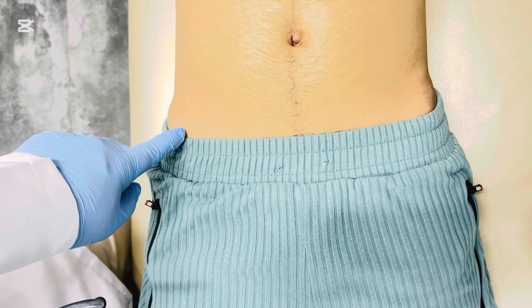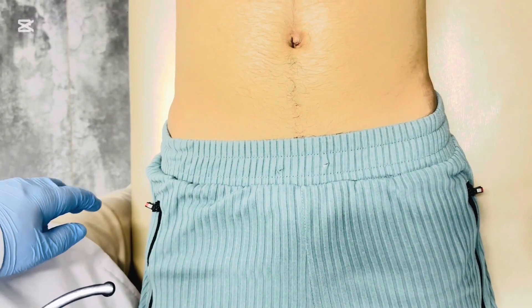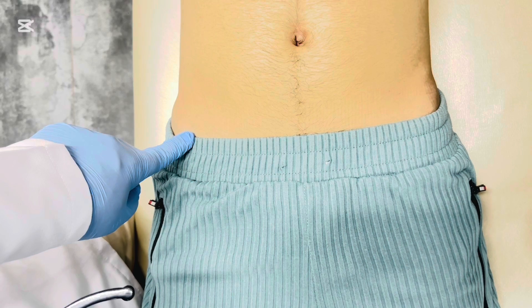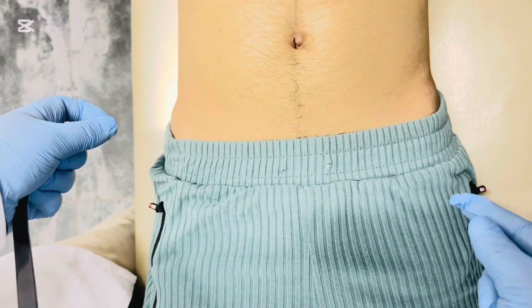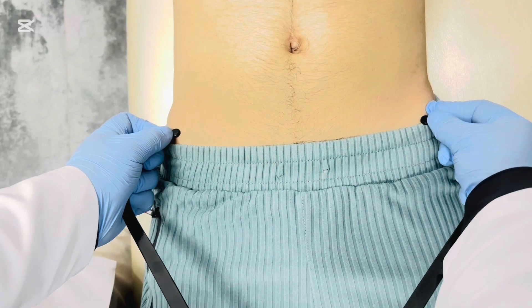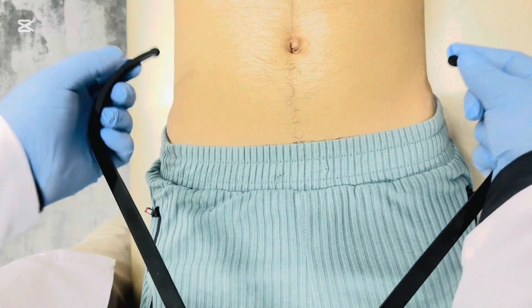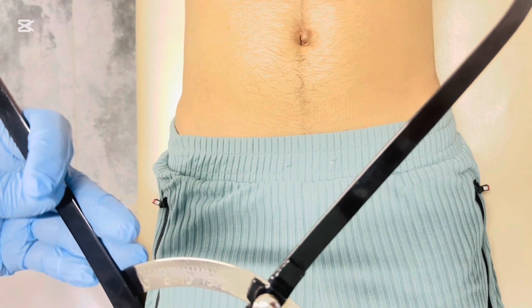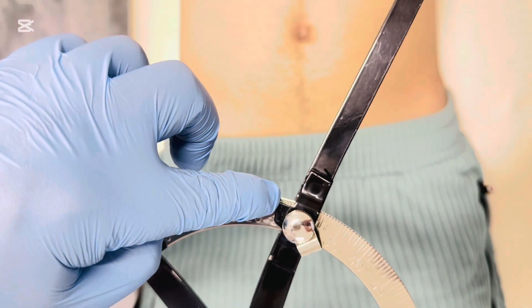First, we have the distantia spinarum. It is basically the distance between the two anterior superior iliac spines. We measure like this, and its normal value is from 25 to 26 centimeters — here it reads 25 centimeters.